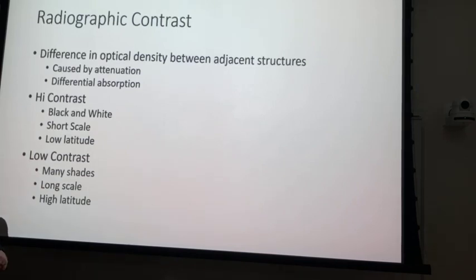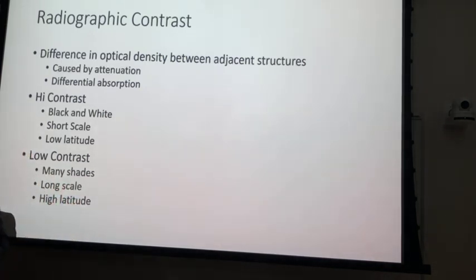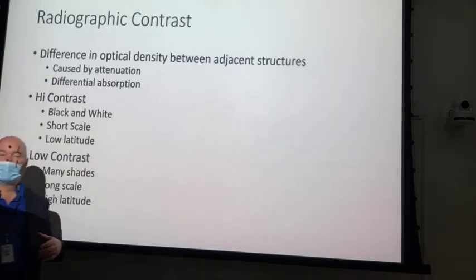Visibility of recorded detail is all about contrast. It's not whether or not those lines are there, it's whether or not you can see those lines, okay? So when we're talking about sharpness of recorded detail, we'll usually mention just detail, right?